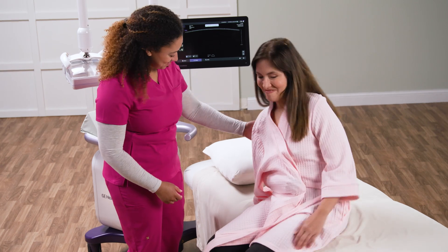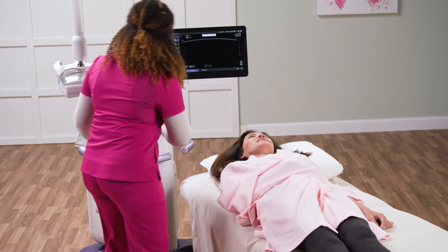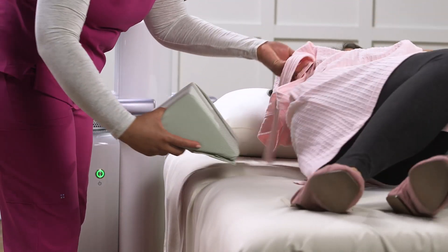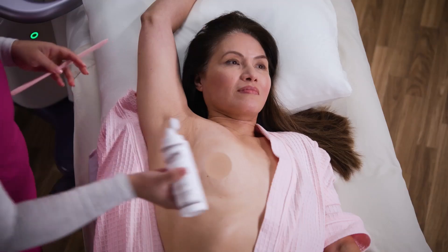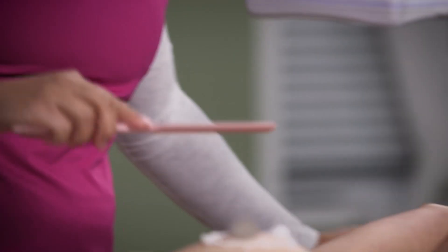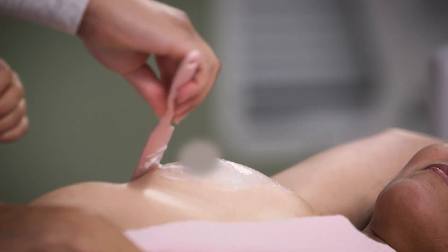Proper positioning is necessary to help achieve high-quality studies. The patient lays supine. Towels or sponges may be used to help evenly distribute the breast tissue and position the nipple pointing toward the ceiling. A thin layer of ultrasound lotion is applied.